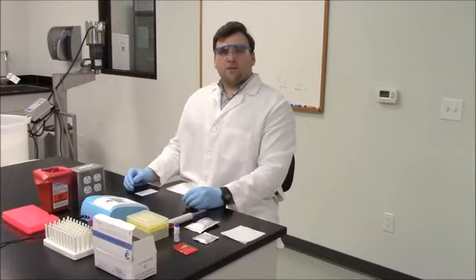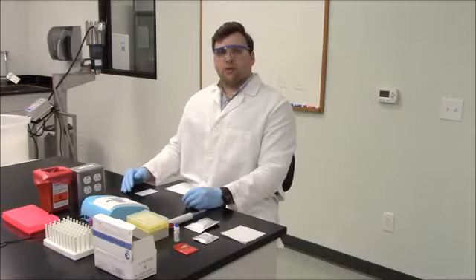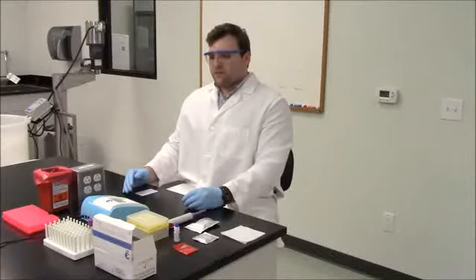Hi, I'm the service engineer for Cellex. This is our equipment, the Helios Luminometer 120. This equipment tests for HbA1c. Fingertip blood or EDTA whole blood are permissible for this test.